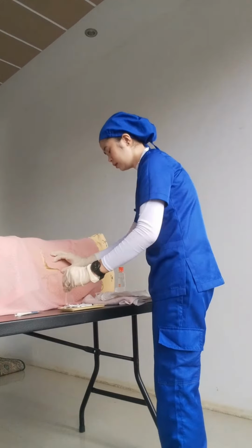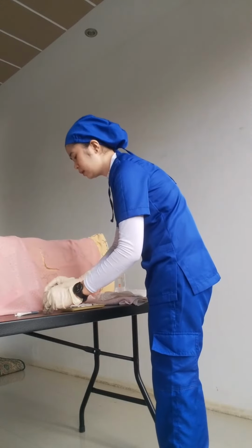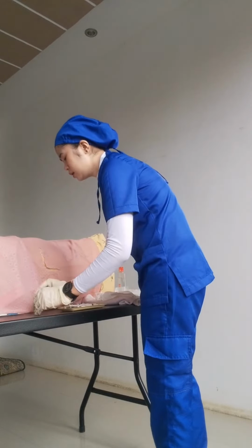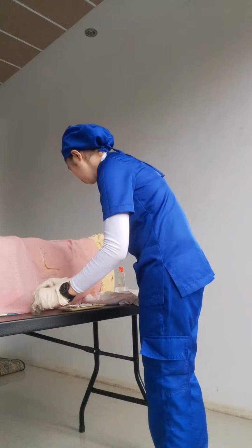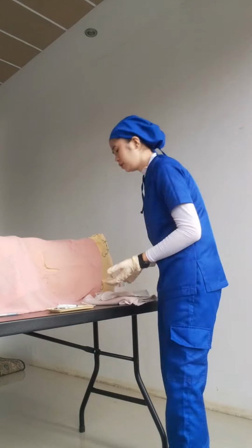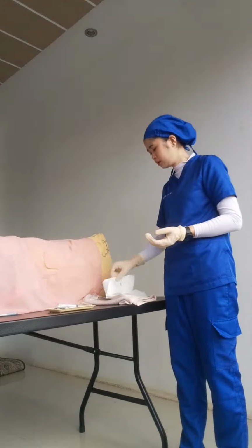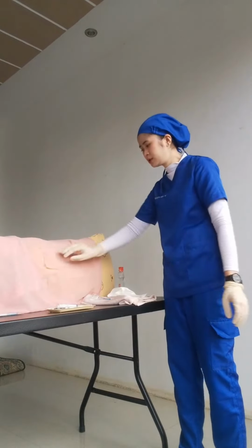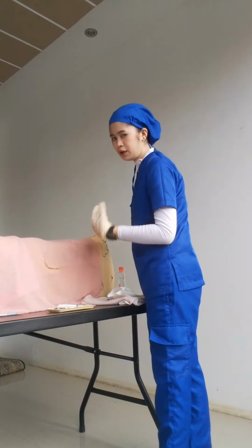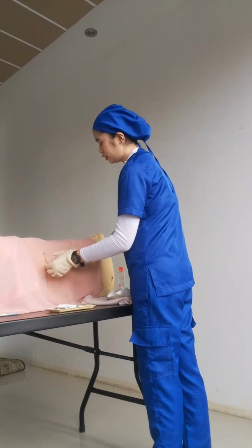And then after that, put the collected specimen in the safety area. Assuming the specimen has already been collected, clean the puncture site to minimize the spread of microorganisms and infection, for infection control, and then cover the puncture site.